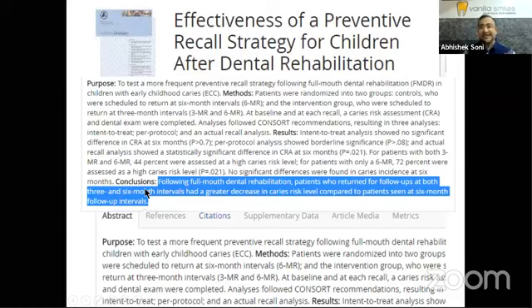And all this happens not just because you were able to deliver quality care. It also happens because parents are equally motivated to come back for their preventive checks. And that's the 30-month radiographic follow-up, all pulpotomies and the vital zirconias doing well for the child.